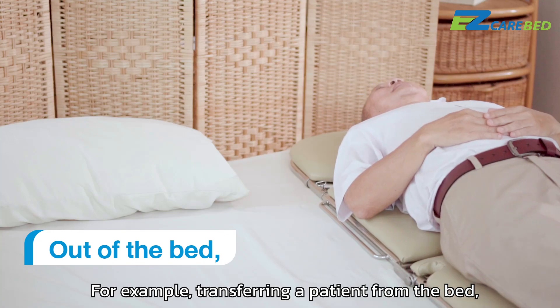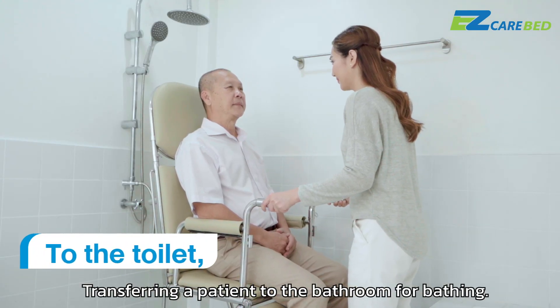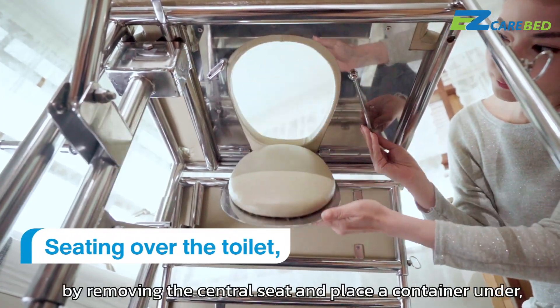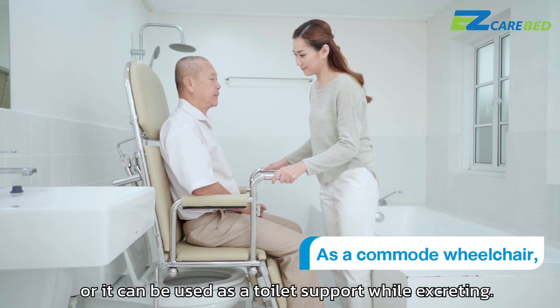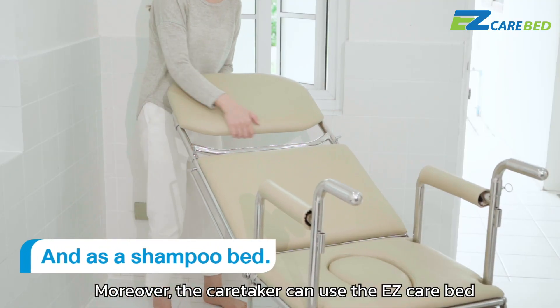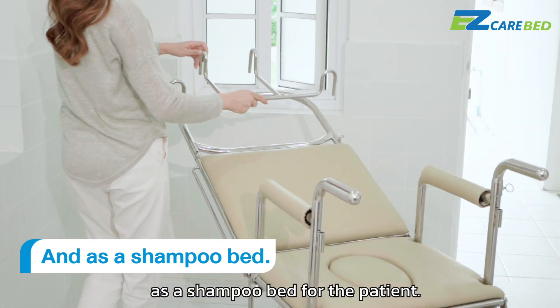For example, transferring a patient from the bed, transferring a patient to the bathroom for bathing. The Easy Care Bed can serve as a commode wheelchair by removing the central seat and placing the container underneath, or it can be used as a toilet support while excreting. Moreover, the caretaker can use the Easy Care Bed as a shampoo bed for the patient.